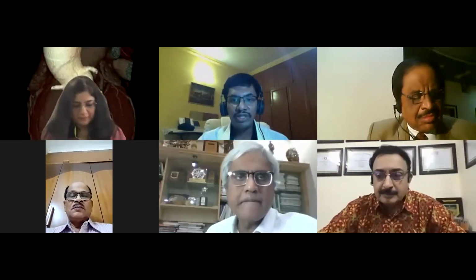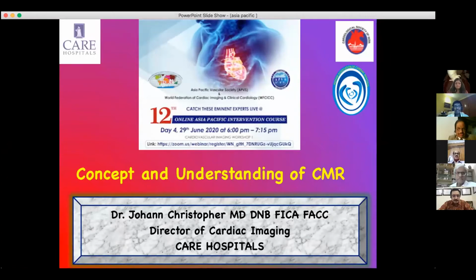I will just share the screen now. So today I'll be talking about the concept and understanding of CMR and giving you a few interesting cases. In 15 minutes, we'll try to get a snapshot of what the cardiac MRI can do.